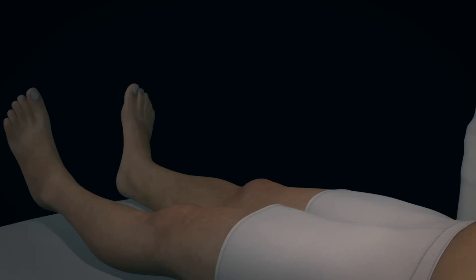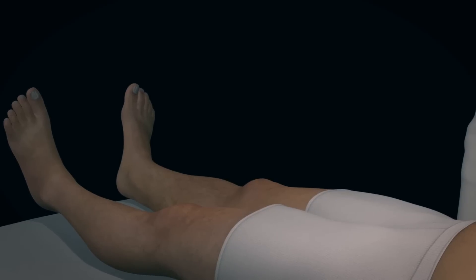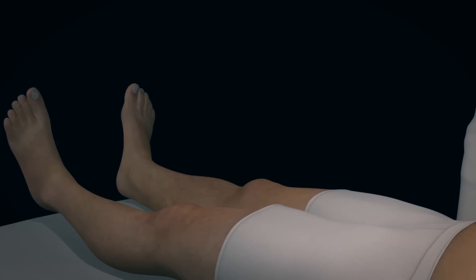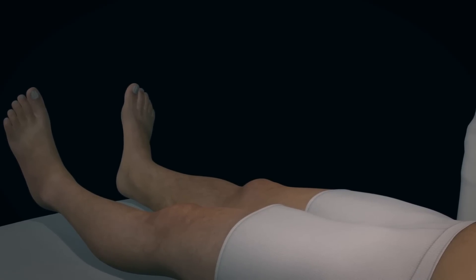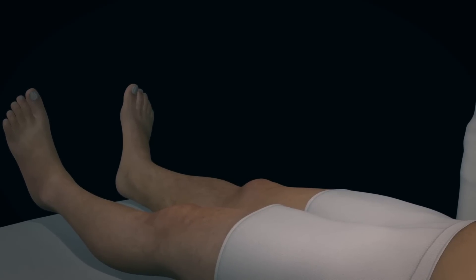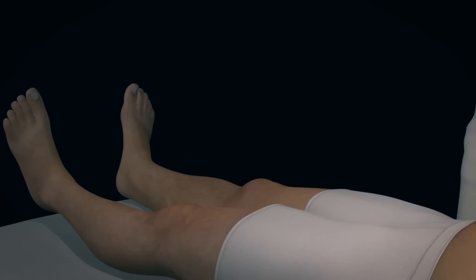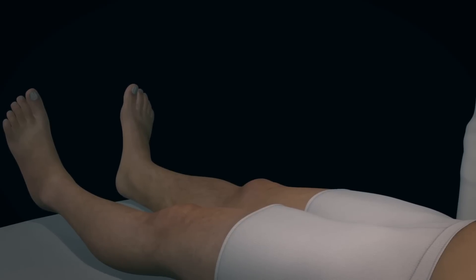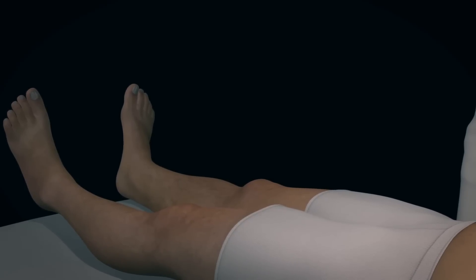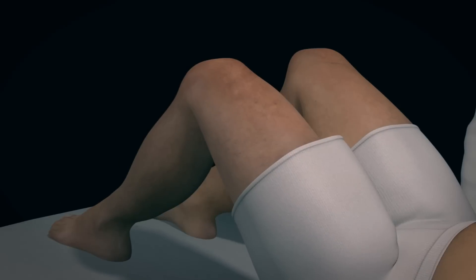When obtaining subcostal images, it is best for the patient to lie in the supine position. Better images can be obtained when the abdomen is relaxed. If possible, ask the patient to place his or her feet on the bed with the knees elevated.